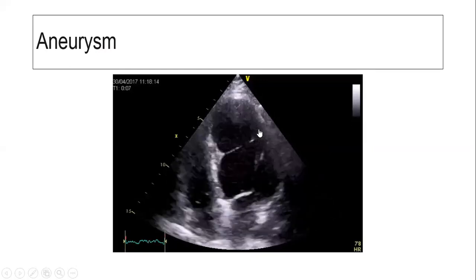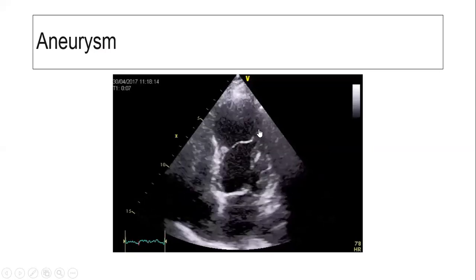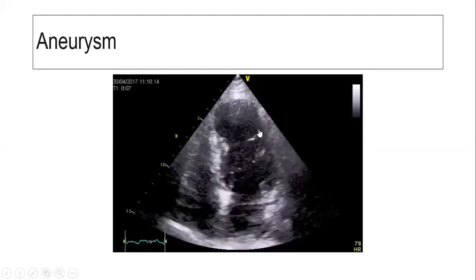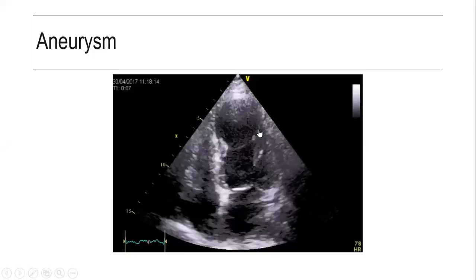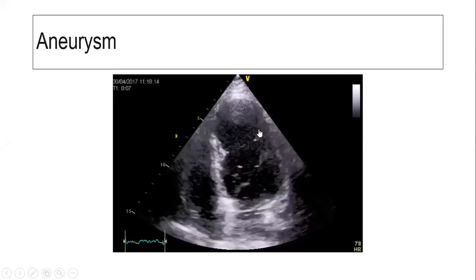Got my word? Anything which has become akinetic, hyperechoic, which has seen no contraction, where the myocardial thickness has gone less than 5 or 6 millimeter, that is burnt out phase completely. It could be applicable in other subjects also, like severe aortic stenosis where LV function has gone down to 25-30%. That is virtually a burnt out aortic stenosis. Or diastolic function going to grade 4, burnt out diastolic function, where any efforts doing something with the patient would not be useful.